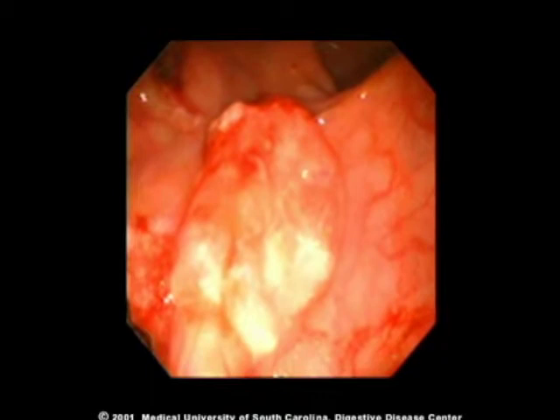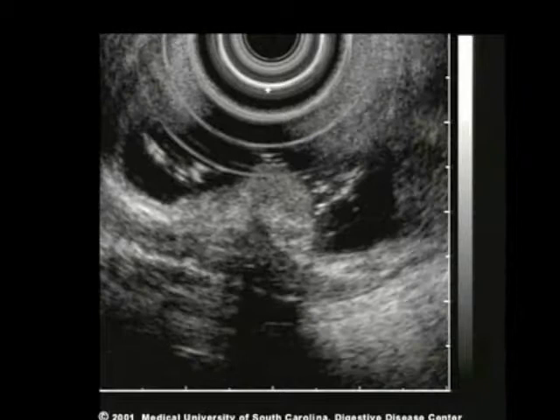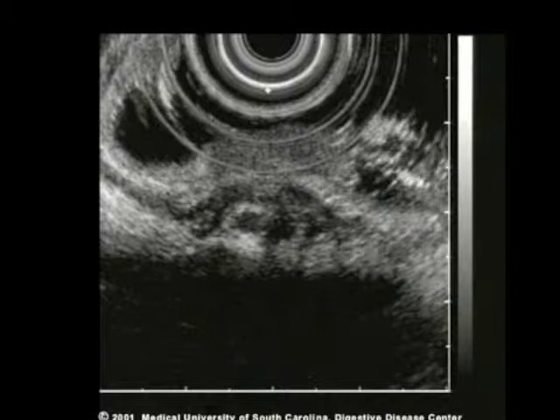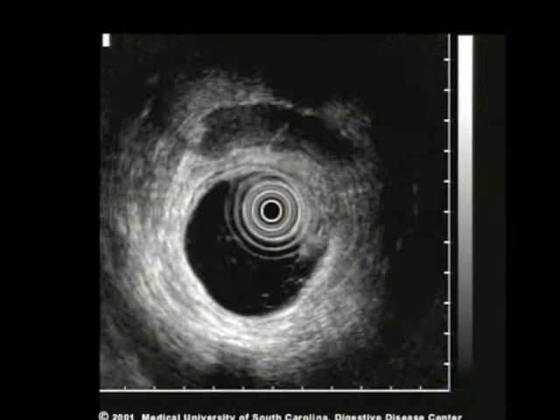This video will demonstrate two different rectal tumors, one of which does not invade the prostate and the other which does. Initially, the endoscopic view shows a typical mass arising in the distal rectal wall. The mass can be seen arising in the mucosal layer but extending and causing marked thickening of the muscularis propria, with an irregular outer margin to the muscularis propria. This indicates invasion into the surrounding adventitia.